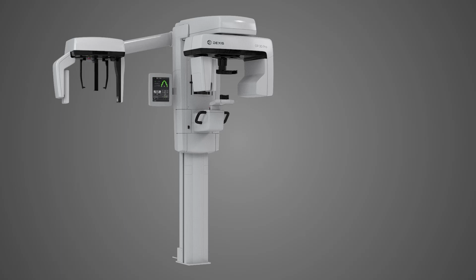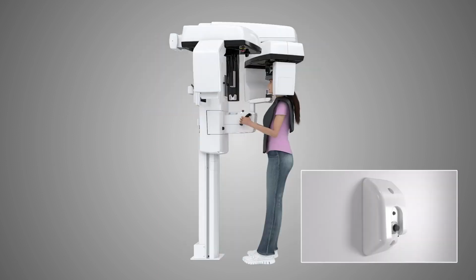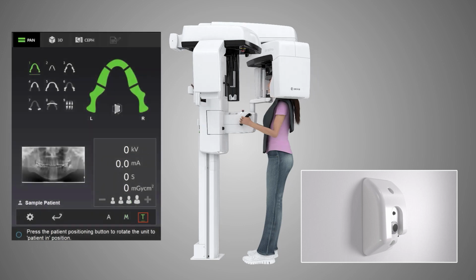Additional information. Exposures can also be taken in a seated position. If you would like to show the patient how the rotating unit works, or if you are concerned about the clearance of the patient's shoulders, you can use Test Mode using the test icon on the touchscreen.